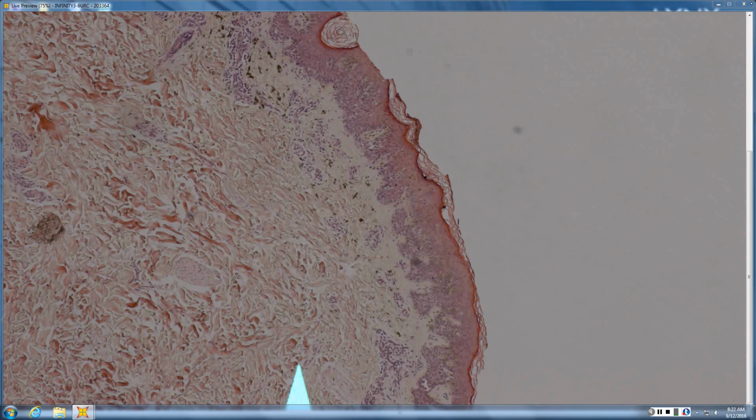So there's pigment in the dermis. Looks like maybe some in the epidermis as well. Yep. And there's definitely a melanocytic proliferation. I see one nest there. By and large, is it well nested? Not really. There's some kind of creeping up, and then maybe you see some things in the arches. So, how big is this thing? It's pretty small. So it's small and it's well circumscribed.